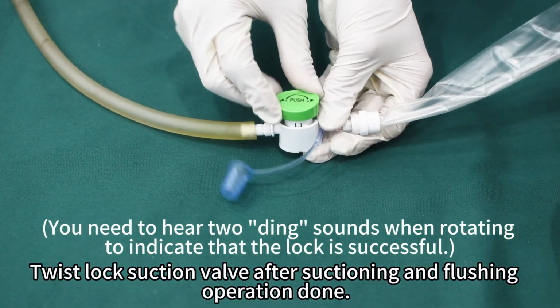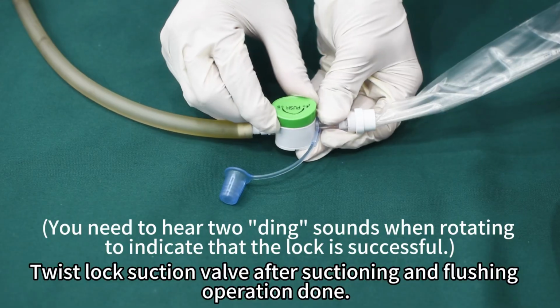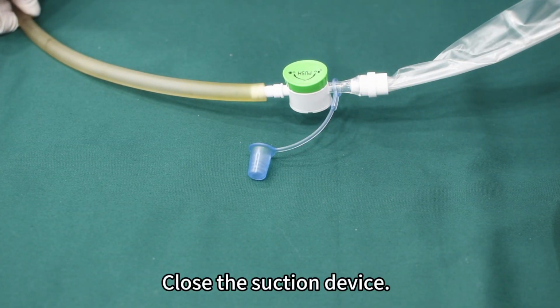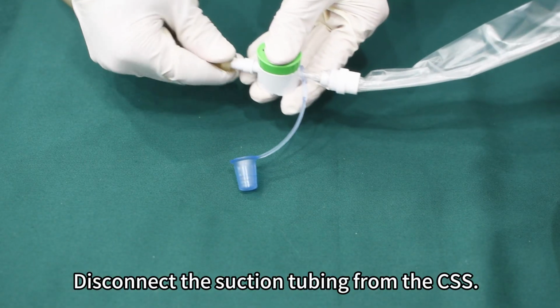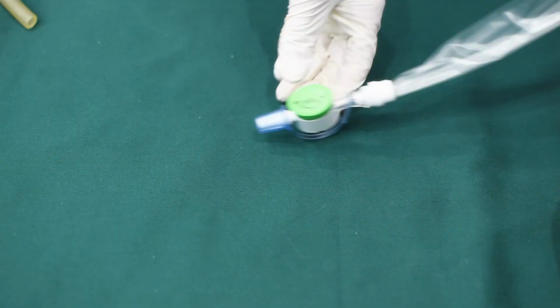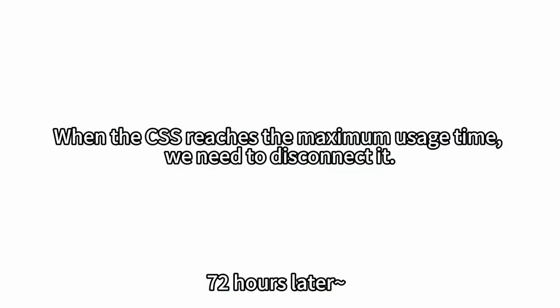Twist to lock the suction valve after suctioning and flushing. Operation done. Disconnect the suction tubing from the CSS. Replace the protective cap. When the CSS reaches the maximum usage time, we need to disconnect it.